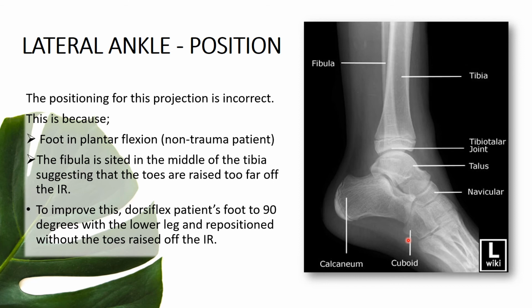Okay, this is the extra info. This is the projection of the ankle of a pediatric patient, because the epiphysis plates are not fused together yet, as you can see here.